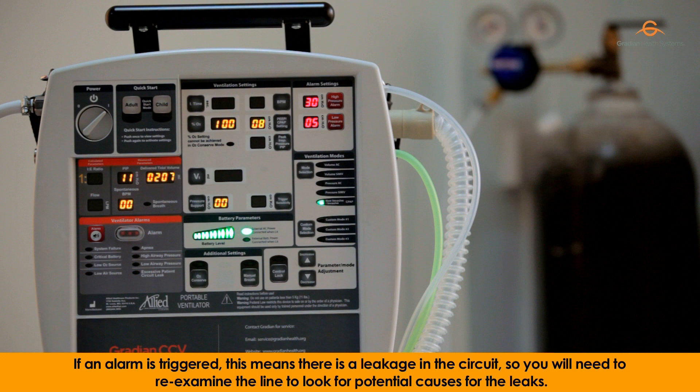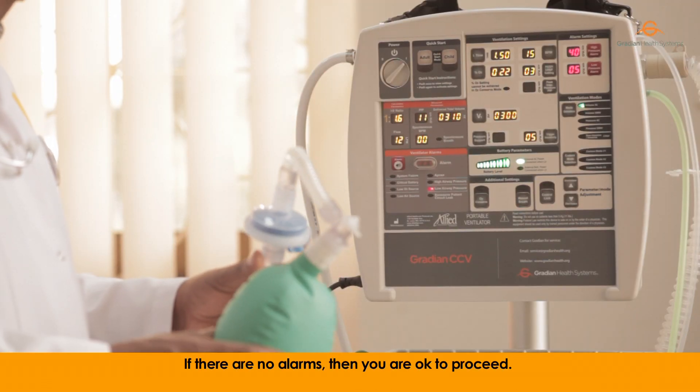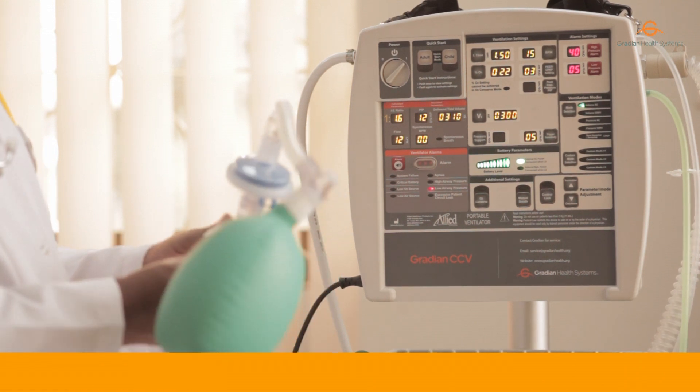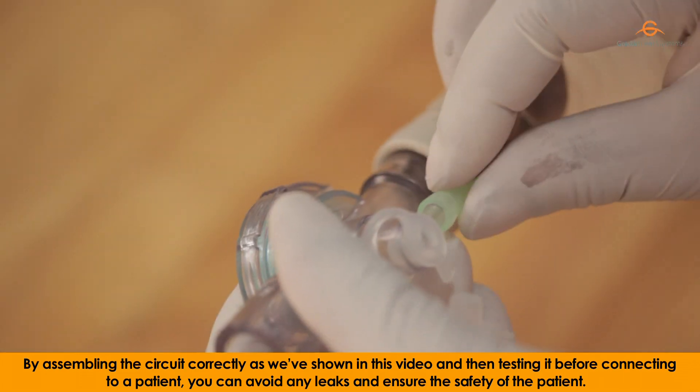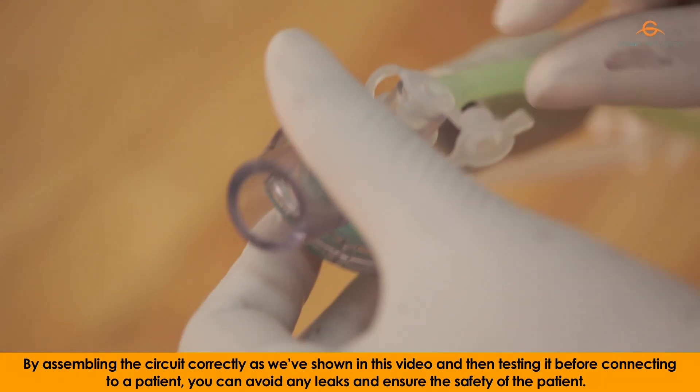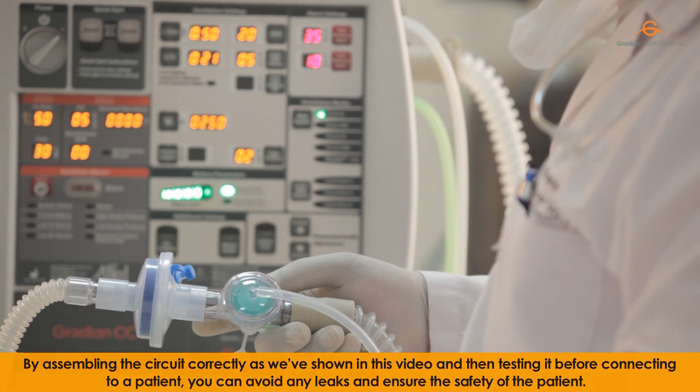If an alarm is triggered, this means there's a leakage in the circuit, so you will need to re-examine the line to look for potential causes for the leaks. If there are no alarms, then you are okay to proceed. By assembling the circuit correctly as we've shown in this video and then testing it before connecting to a patient, you can avoid any leaks and ensure the safety of the patient.